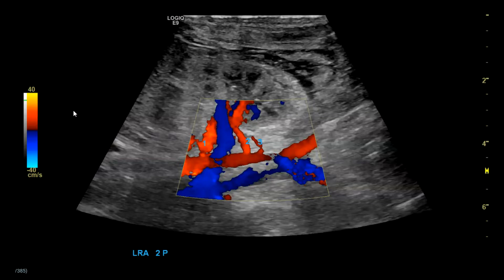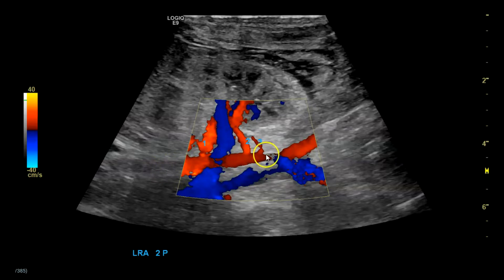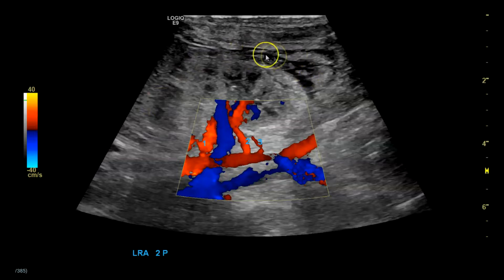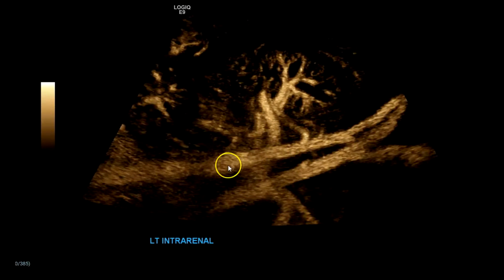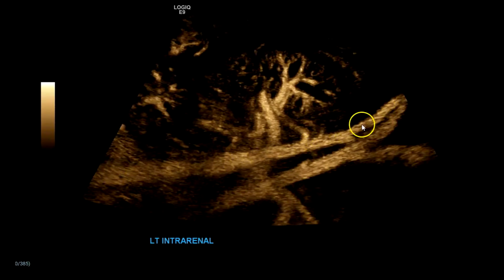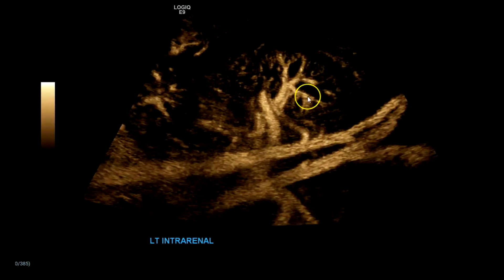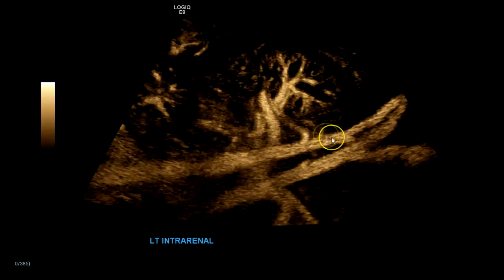Let's go over supernumerary or multiple renal arteries. Here we have an infant with the aorta and one, two, three renal arteries going to the kidney. There's some edema here. Let's look at that same area with B-flow. Here you have your aorta going into the bifurcation. I'm approaching this kidney from the left side, so this would be the left kidney. These are the intrarenal vessels.